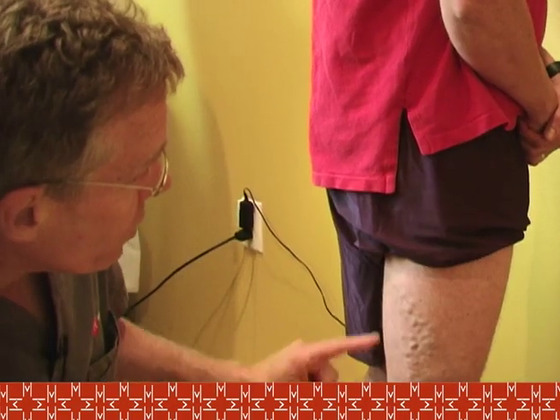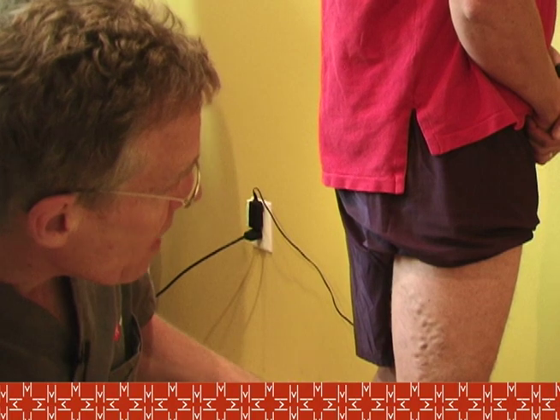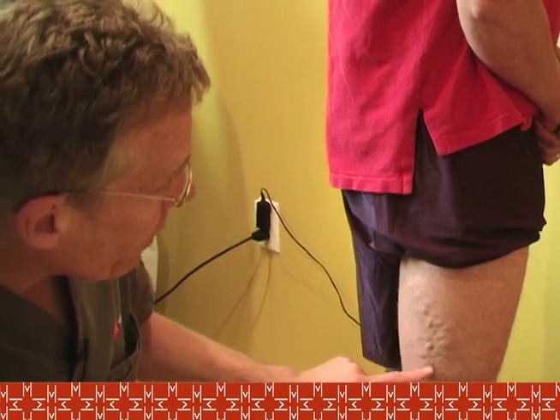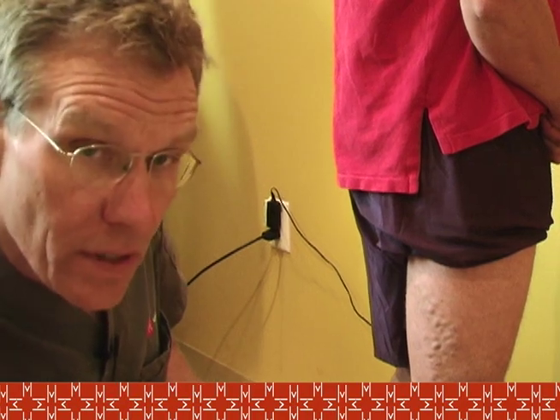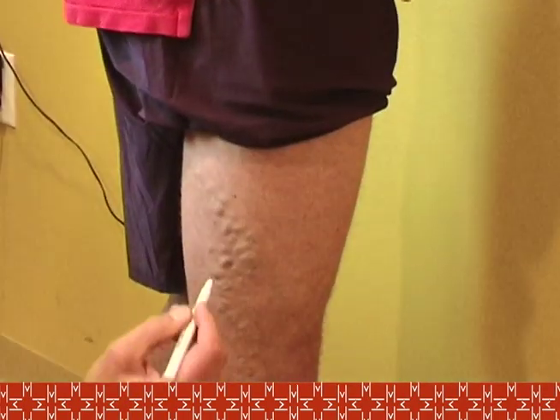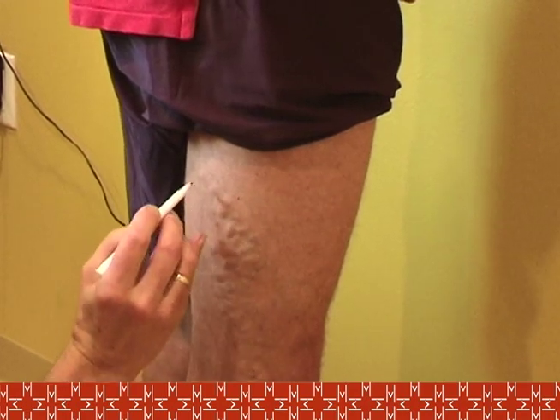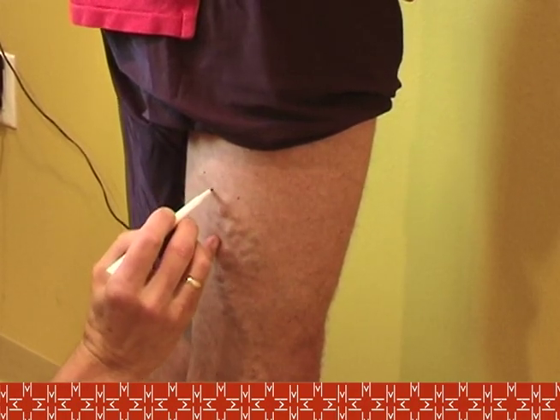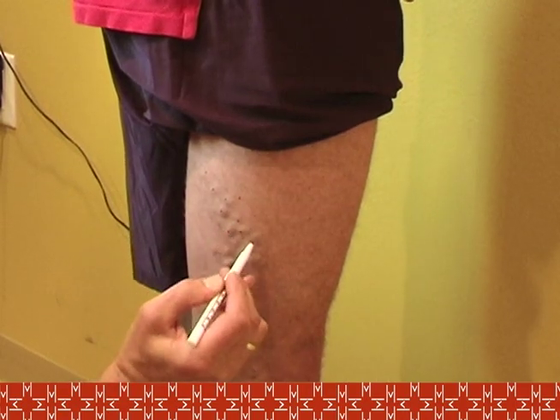I'd like to show you on our patient the venous pattern that we were left with after our previous procedure. Our approach today will be to mark or outline this vein on the posterior and lateral aspect of the right leg. The first thing I do is mark the vein while the patient is standing, as when we lie down it's not as apparent. I do so with this indelible pen.